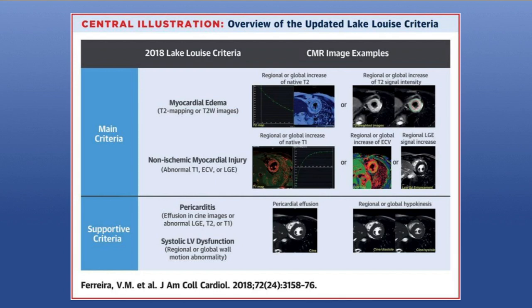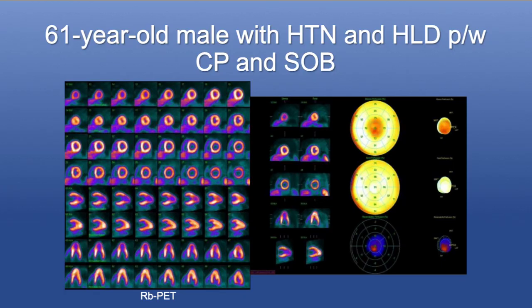That is something that in MRI, if we really want to rule out obstructive CAD in these patients, we'll have to do stress perfusion, which can be a little bit tricky when you have a patient that has positive troponins and you don't know if they're having active myocarditis. So I think both tests are good. I think MRI is probably better right now, but CT is a growing contender and potentially could be useful in certain different patients. Which patient would be better for one versus the other still needs to be determined.